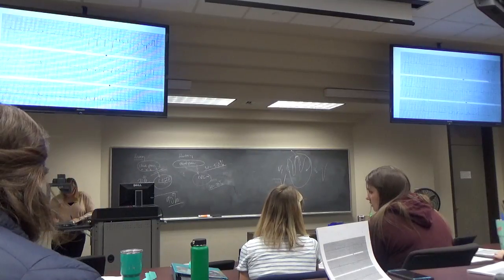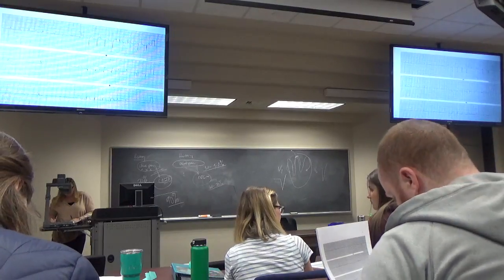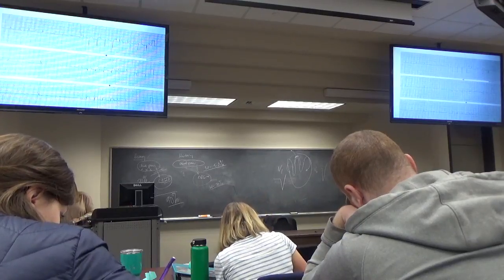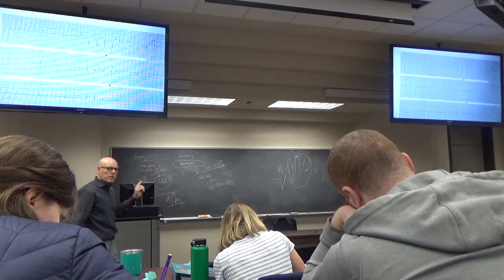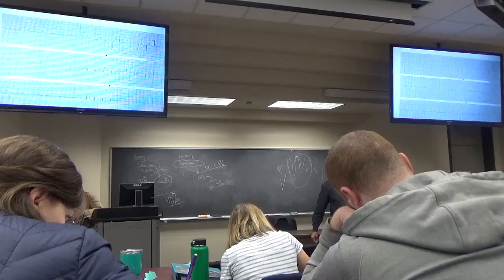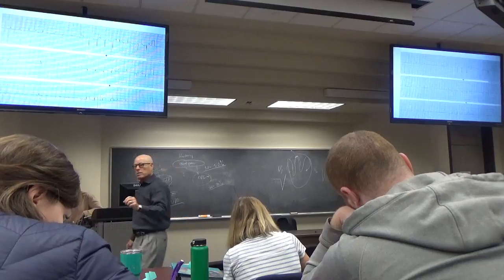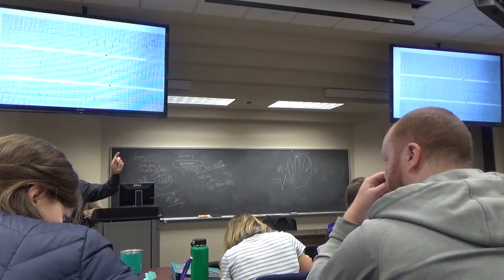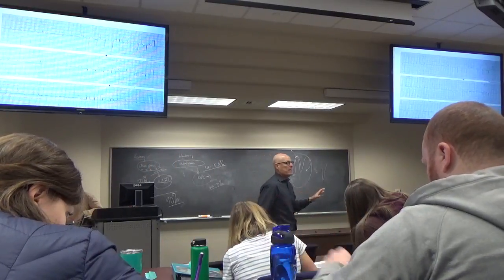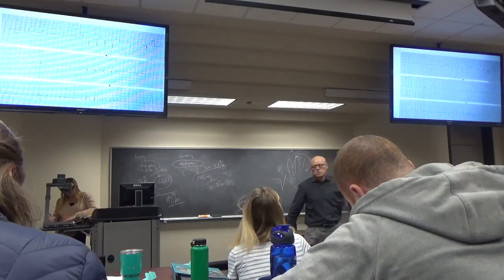So there's an exception to the Q wave rule. If there's a pre-excitation syndrome, you can't call it an infarct, because you don't know how those ventricles are being activated. That's one of the exceptions to the Q wave rule. The Q wave rule means if the Q wave is greater than 0.04 seconds, there's a left ventricular infarct, transmural. Unless there's a short PR interval and it's pre-excitation, then you can't call it, because you don't know where that ventricle is being activated from. Does everyone understand how the Q waves get formed here? Now remember this.